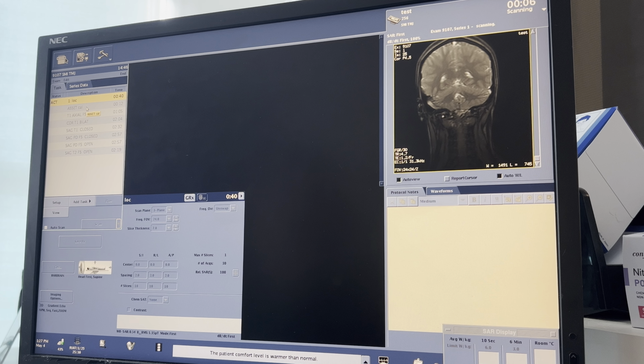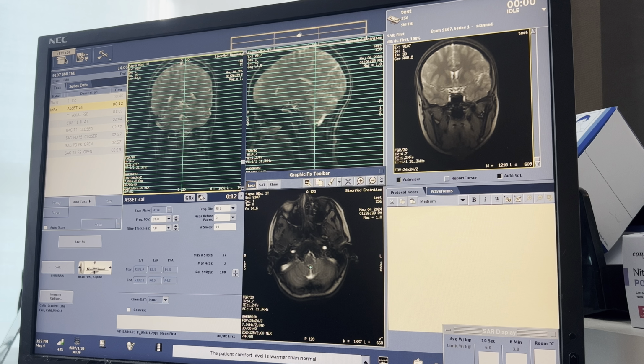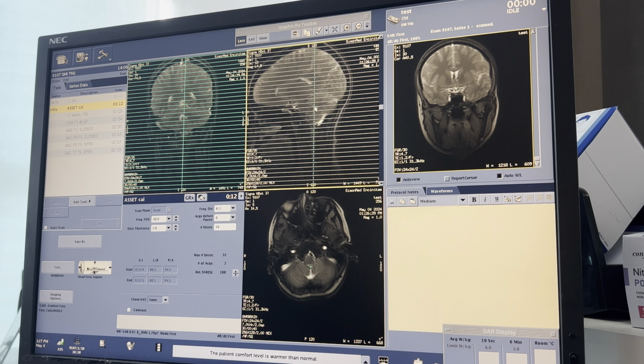Let's go into the calibration. Let's go into it, or you can click setup if it's not fast enough. There you go. Let's just drop it right in the middle, right here. Everywhere you have slices is where you'll get signal. Let's move that up. Okay, cool. Let's run that.